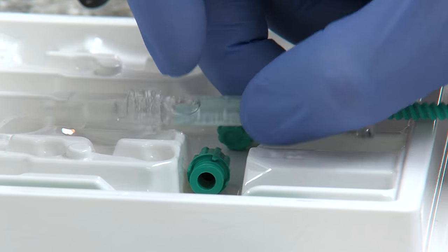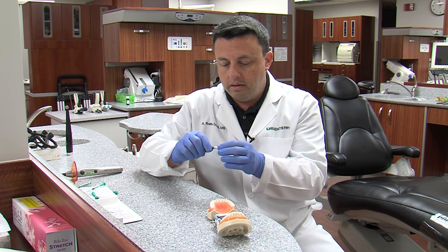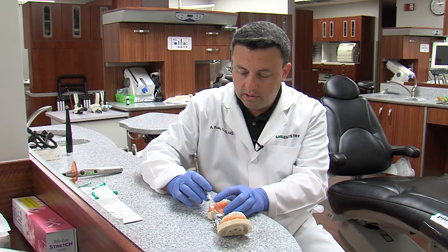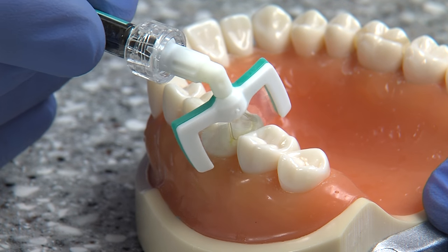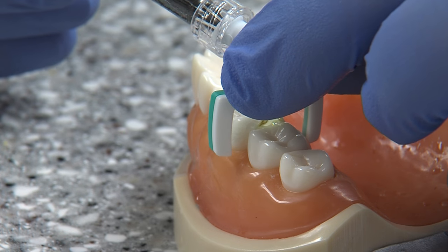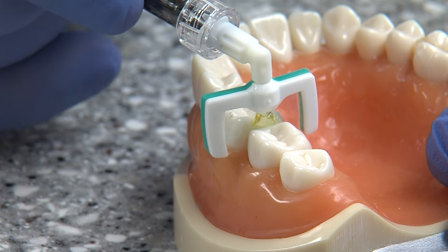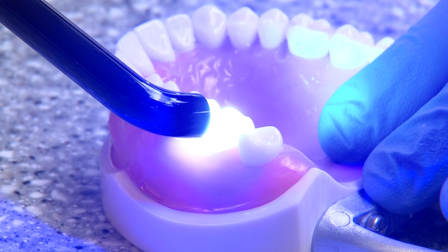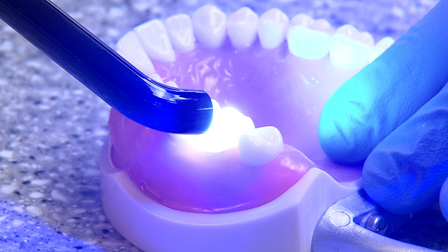It comes in the same type of system — a little applicator that can go in between teeth. We'll slide it in and squeeze the resin out. After three minutes, we'll remove this and light cure it. Once it's dry, we apply this light to set it and make it hard.